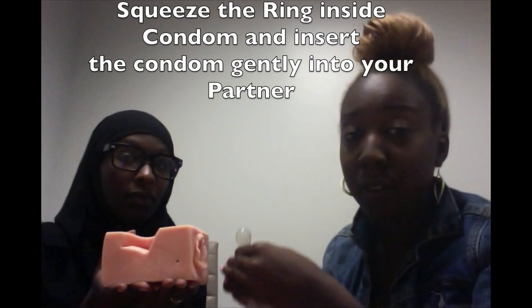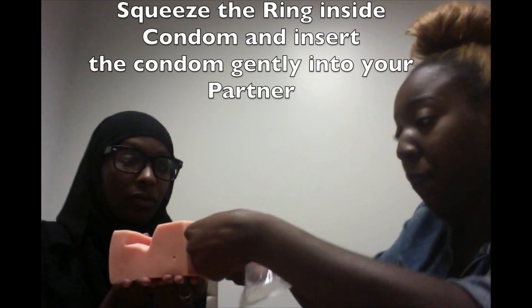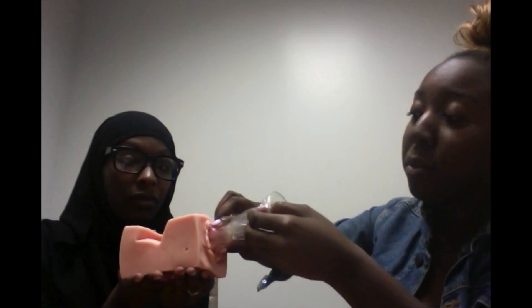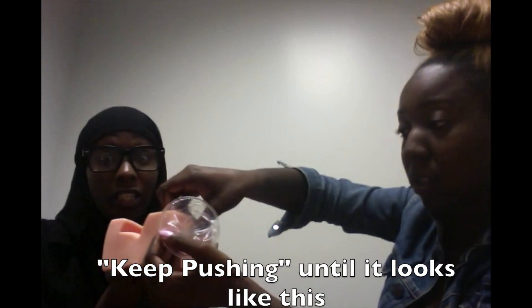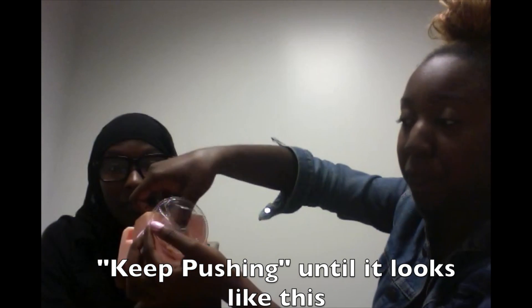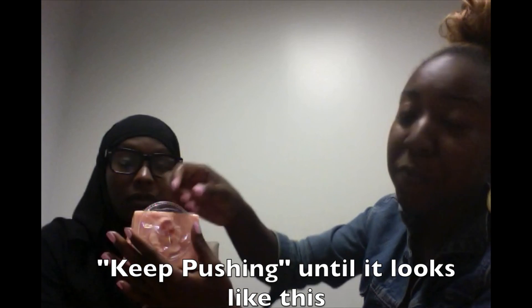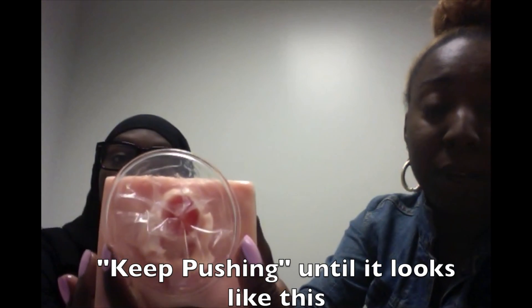When inserting the female condom, you're going to squeeze the ring to insert it in. Just keep pushing it until it's all the way in — gently, of course. Can you turn it this way so that you can see? Basically, it should pretty much look like this when inside the female vagina.